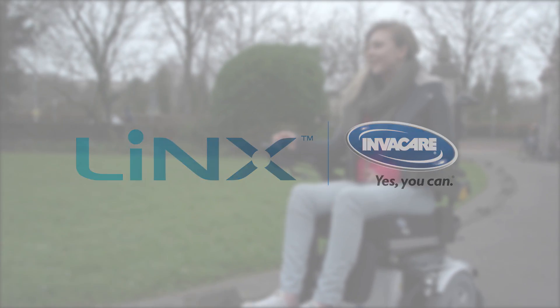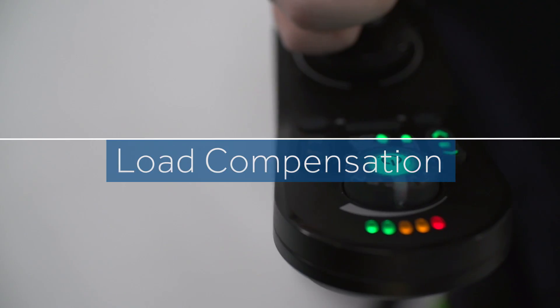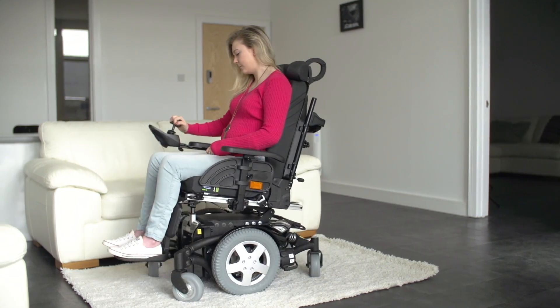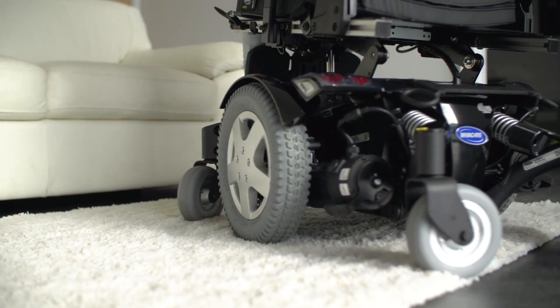What is dynamic and adaptive load compensation? Power chair users often have great difficulty when turning slowly on soft surfaces such as a rug. This results in the casters locking followed by a sudden jolt when they finally release.